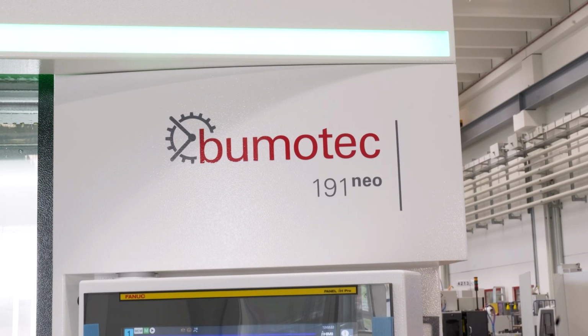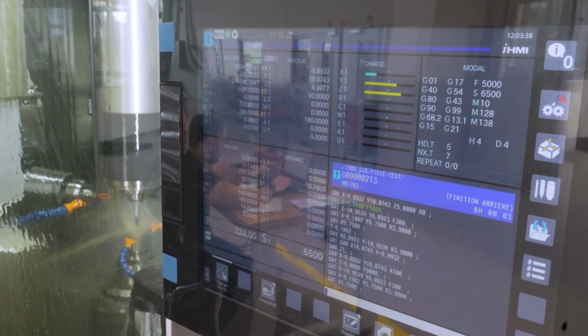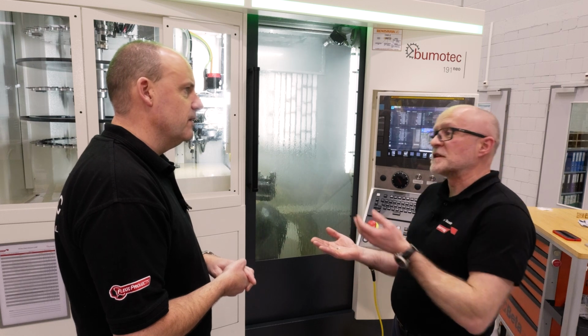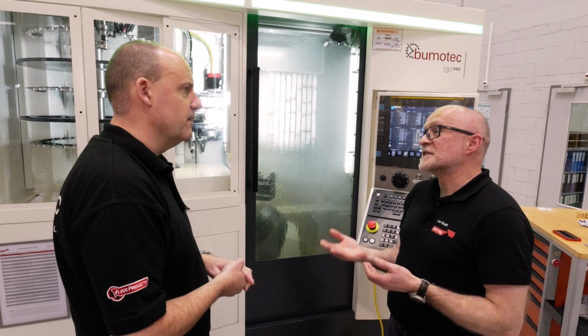And one of the advantages that we have on this machine is these are made in batches, they're small batches, so you could make these on other machines. A sliding head lathe, for example, this is what I was thinking. You could, but there's zero setup on this machine. If you change from one family to the next family, you simply load another program, and that's where you're saving your time.